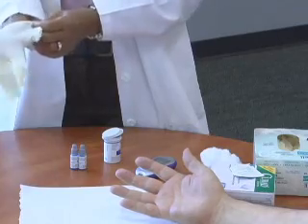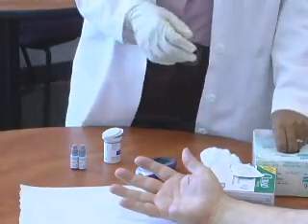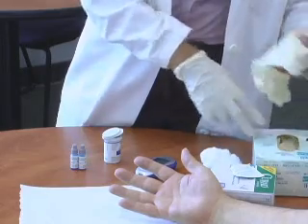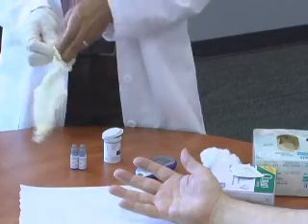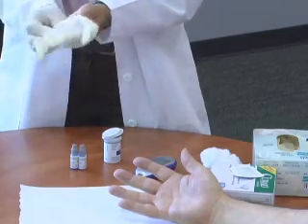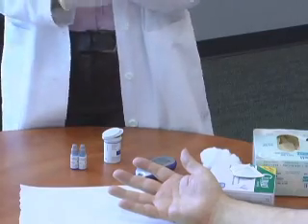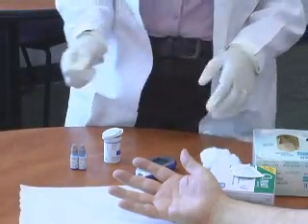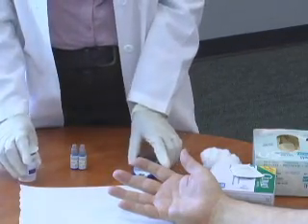Then you place on your gloves. You probably want to use two gloves. If you have a ring on, you probably want to turn the diamond or stone inside so that it's easier to get the gloves on and off. Or, if you know you're doing a really big screening, I would leave your wedding rings at home, because you don't want to accidentally pull off your glove and lose your ring inside it and throw the glove away.